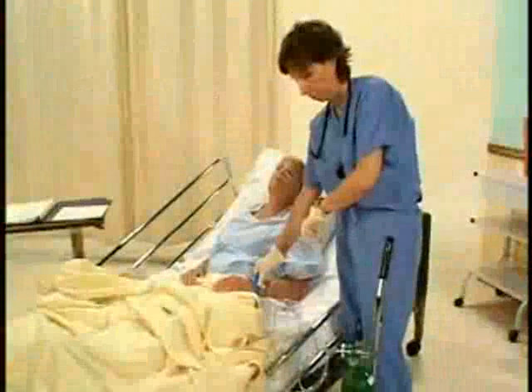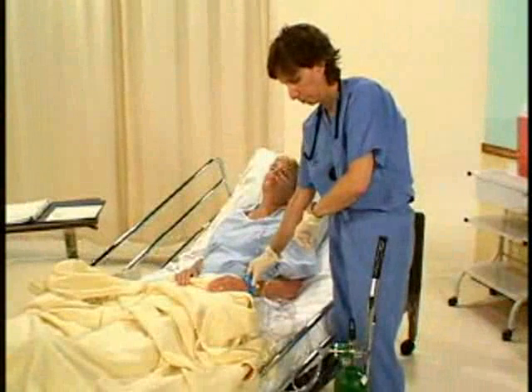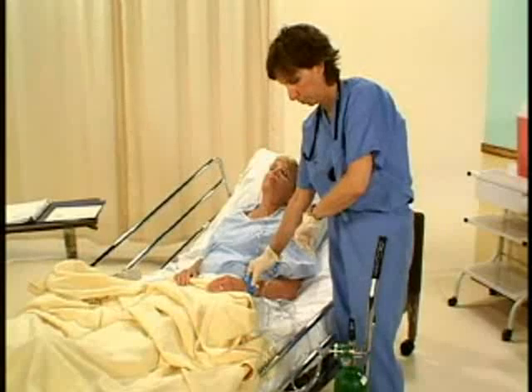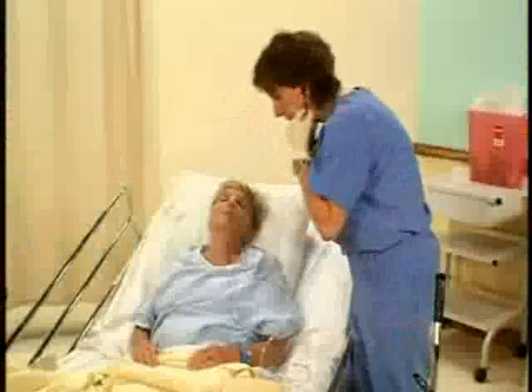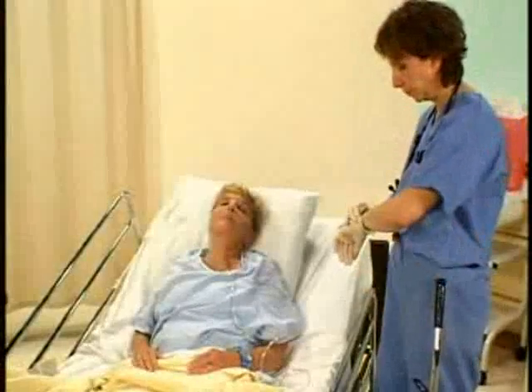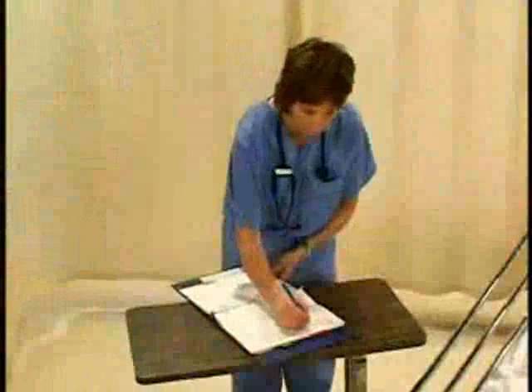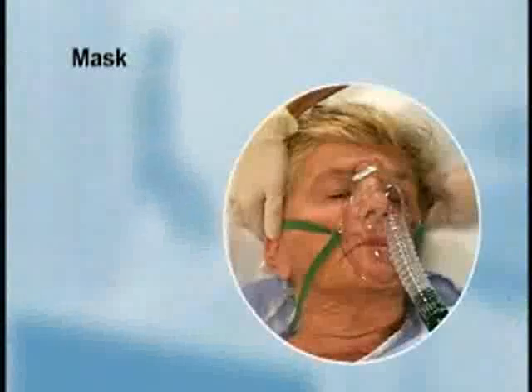Monitor vital signs, oxygen saturation, and the client's condition every four to eight hours for signs and symptoms of hypoxia. Oxygen is not without side effects and should be used only as long as needed. Wean the client from oxygen as soon as possible using standard protocols. Remove your gloves, wash your hands, and document the procedure.